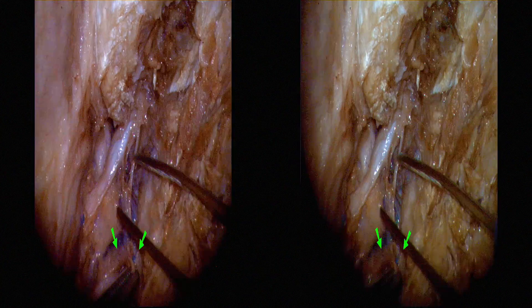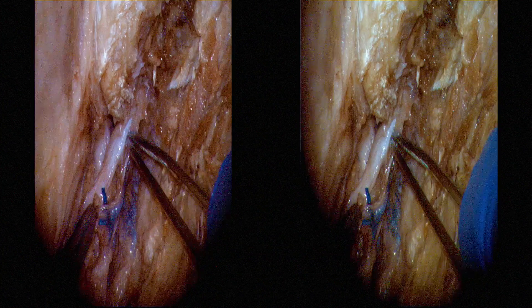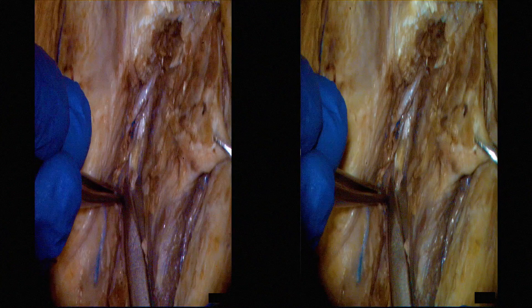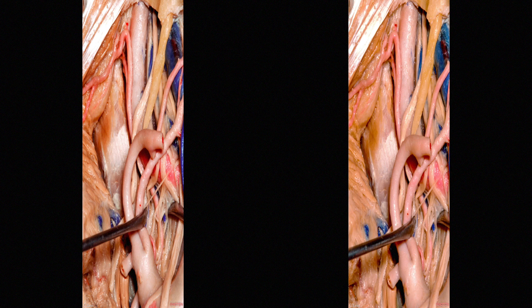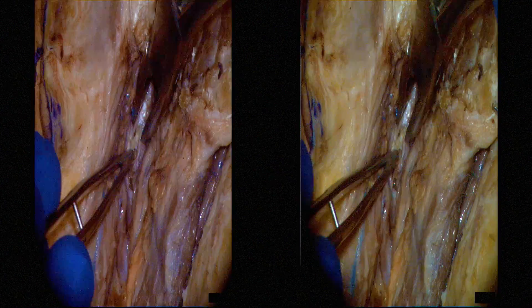Here one sees the stylomastoid artery, which typically arises from the posterior auricular artery. The stylomastoid artery should be preserved because of its blood supply to the mastoid segment of the facial nerve. The facial nerve is retracted anteriorly to expose the extent of the styloid process. Removal of the styloid process is necessary to expose the internal carotid artery immediately below the skull base, and should be done when the internal carotid artery is encased by or supplies the tumor. In this case, the internal carotid artery was not involved, so this step was not necessary. The styloid process is removed with a rongeur.